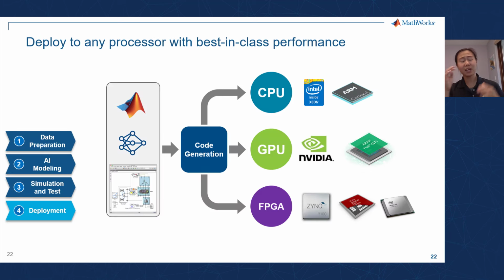Okay, and then finally, I will highlight that there is a section in this example that does go over code generation for embedded devices, but it's not something that we'll have a whole lot of time to talk about right now. But basically, the question is, okay, I've trained this thing, now what, right? And the answer is, now you've got to put it somewhere so that it can do something useful.